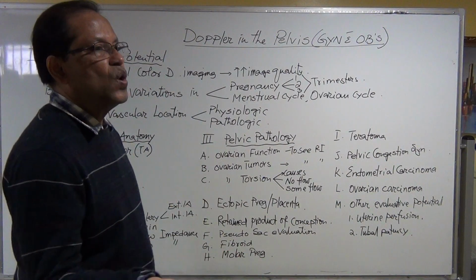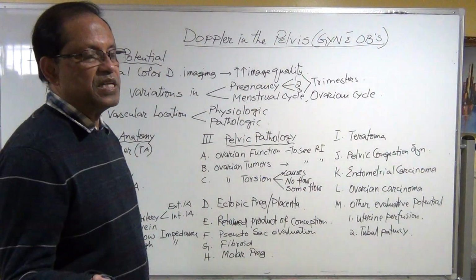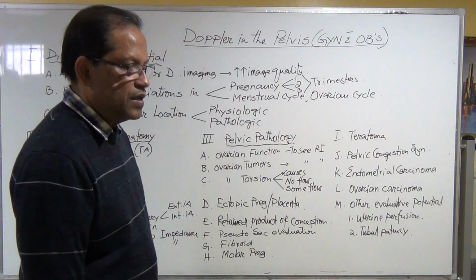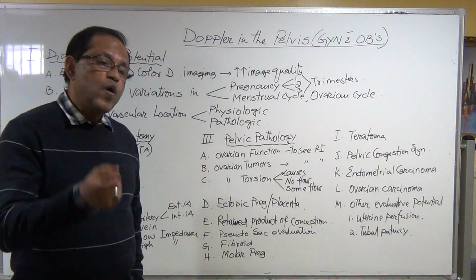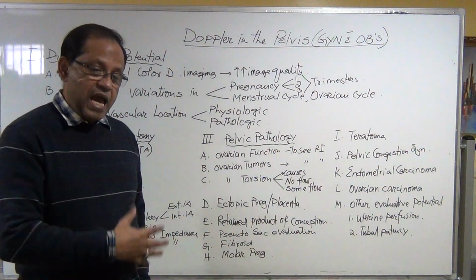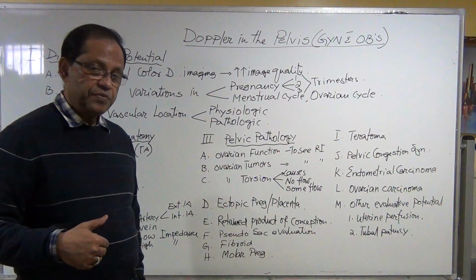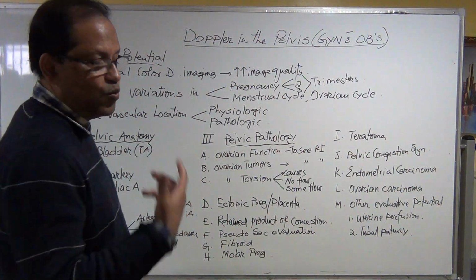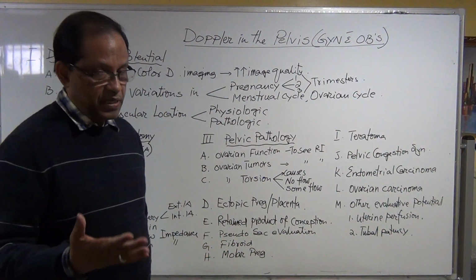And there is no other sign of pregnancy, meaning no fetus, no embryo, no yolk sac. So it could be a coexistence of a normal pregnancy and a molar pregnancy at the same time in the uterus. There is a twin pregnancy, one could be the normal, another could be the molar pregnancy.